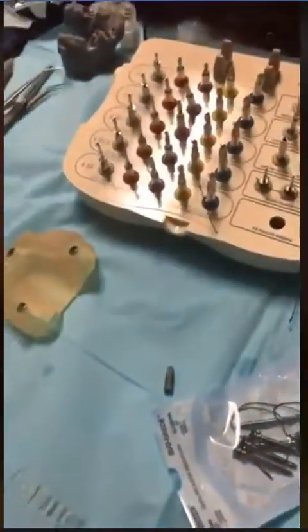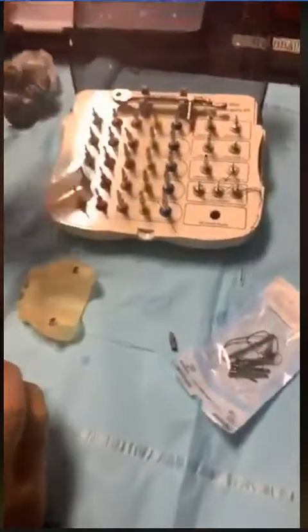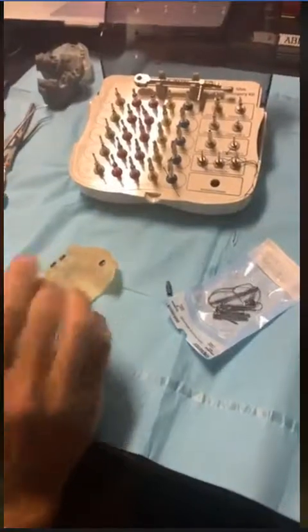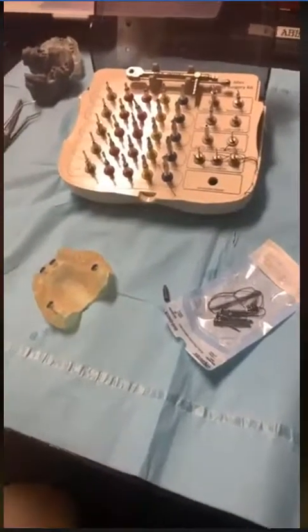We're going to close this, but I want to keep that fixation pin out so we can go ahead and go through with this. So now I just want to show you, if Pierre, would you mind coming over here to the computer?